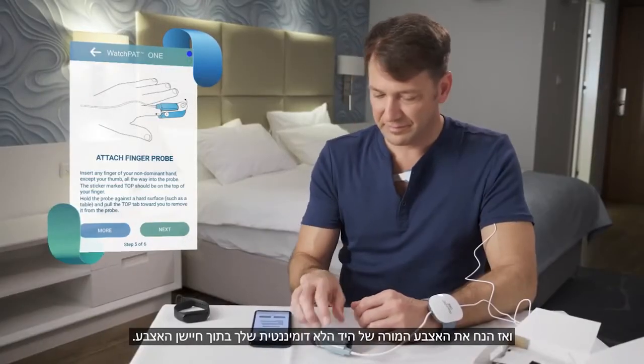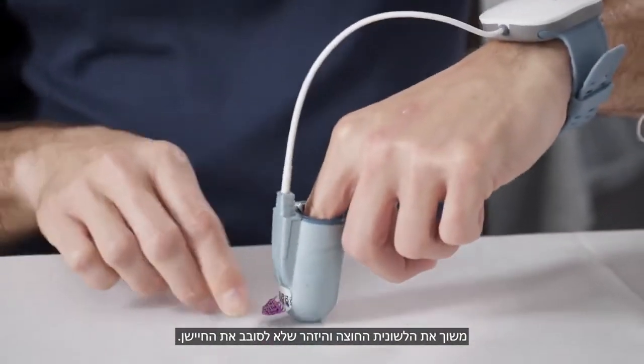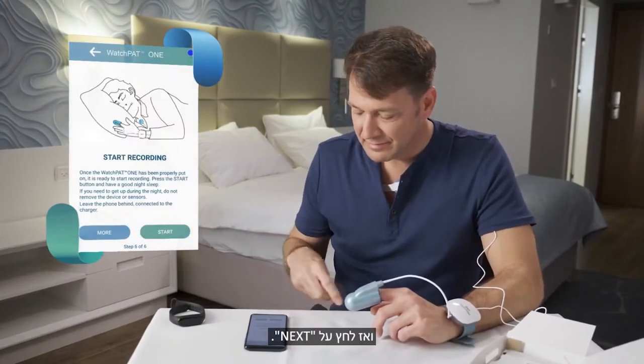Then place the index finger of your non-dominant hand inside the finger probe. While pushing it against a hard surface, pull out the tab. Be careful not to twist the probe. Then press Next.